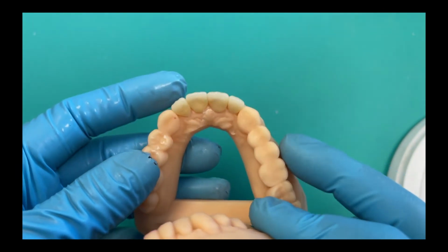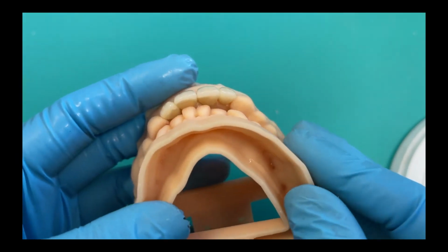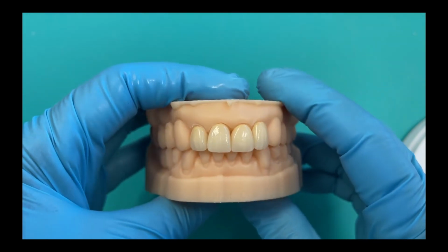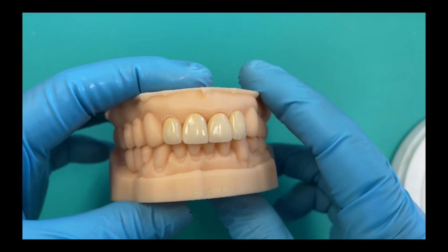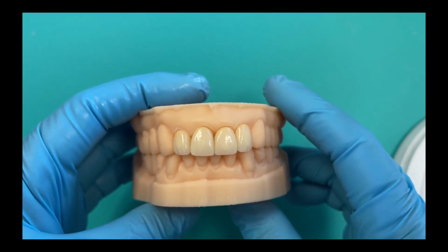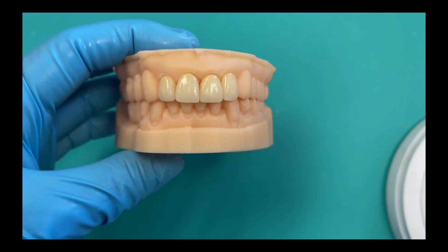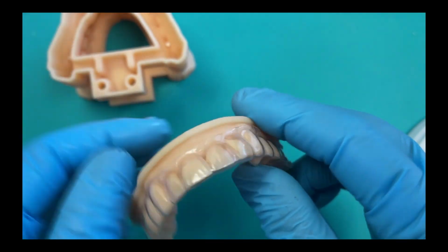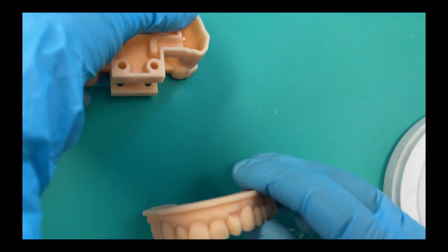So tooth number 7 got a no prep veneer. Tooth number 8 got a new crown. Tooth number 9 got a no prep veneer. And tooth number 10 got a crown because, as you'll remember, it was super rotated with that distal edge kicked all the way out to the facial. So this is, in reality, what most restorative cases look like. It's not that often that you get to do all the teeth as no prep, but if you can do half the teeth as no prep, that's more conservative.